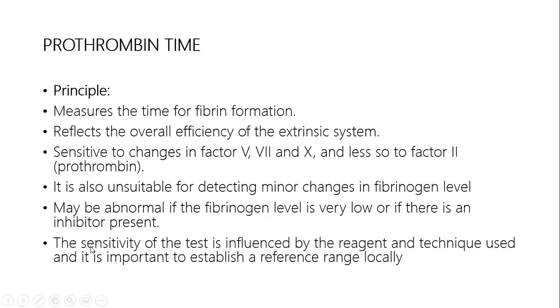The sensitivity of the test is influenced by the reagent and technique used, and it is important to establish a reference range locally. So pareho lang sa ginasulit-sulit naman gina-emphasize ni Miss Yvette, right? Kada laboratory, lain-lain ang reference range nga ginaset. Because number one, pwede lain-lain nga machines or different machines nga ginagamit, lainay man ang reagents nga ginagamit, right? The same man as a prothrombin time, guys.